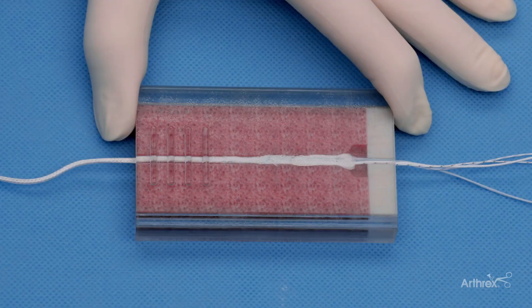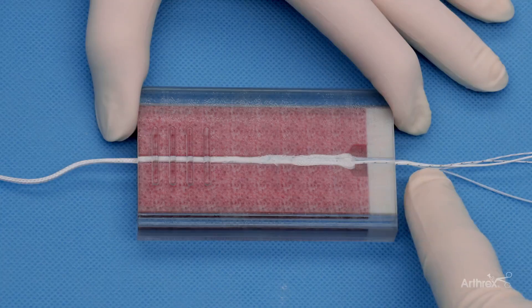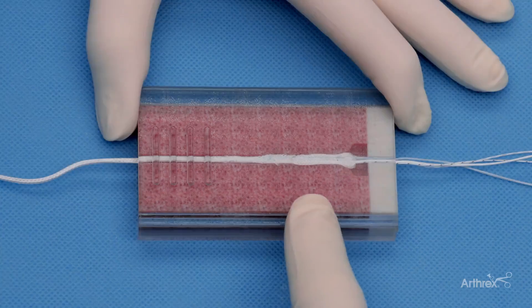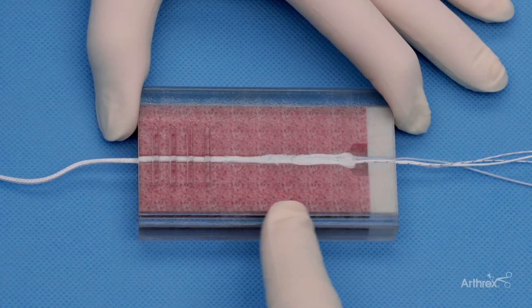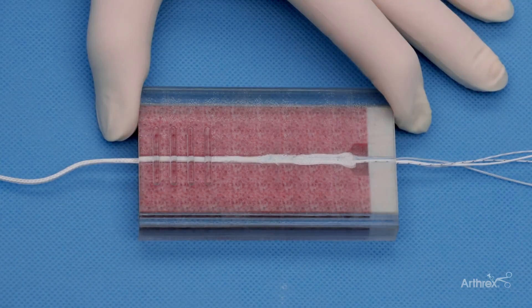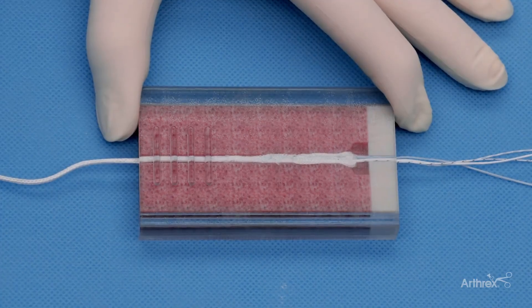This is a 3D model that shows how the SutureLock Implant works inside the knee and specifically the tibia. These are the repair limbs that will be utilized to repair the meniscus root. This is the tibia cortex in which the sheath will bunch up under and securely hold the meniscus root repair. This is the tibia cancellous bone tunnel in which the SutureLock sheath is deployed. This represents the anterior aspect of the tibia where the sutures come out to do the meniscus repair, but also to set the sheath with the sheath setting suture.